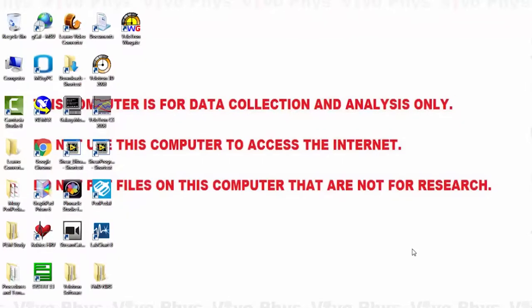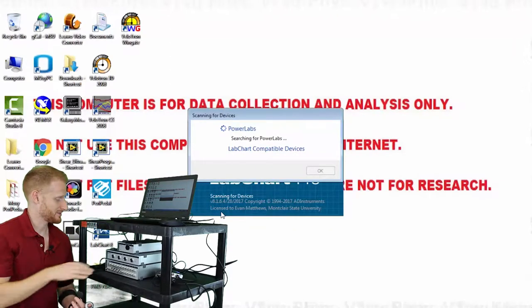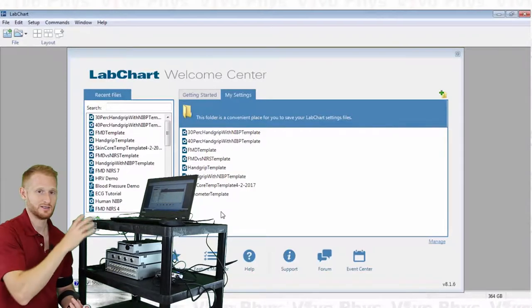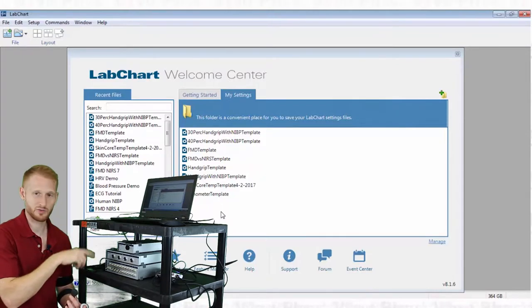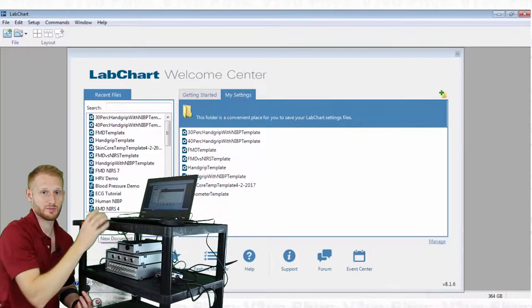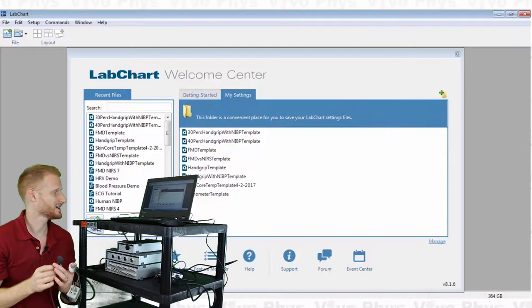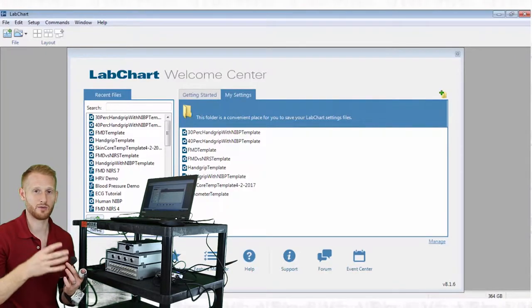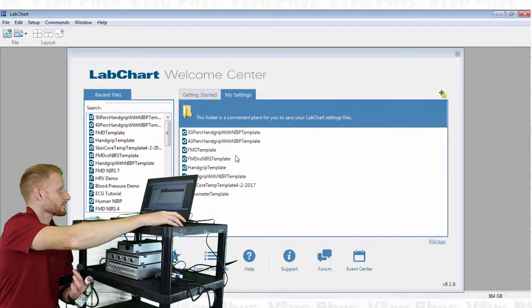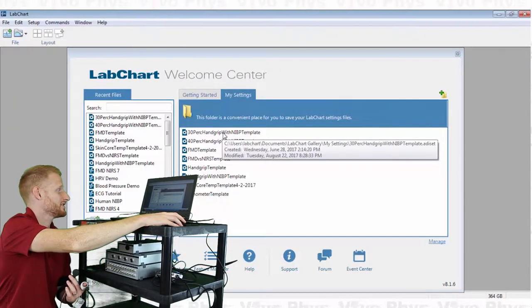Now I'm going to open the LabChart 8 software. You can see it's loading and looking for different devices, making sure the PowerLab is connected and turned on, and also that the NIBP unit is connected and turned on. No errors popped up, so everything's connected. Rather than opening a new file without any previous settings, I'm going to open this 30% handgrip trial settings file, since the NIBP has a lot of setup already configured within it.